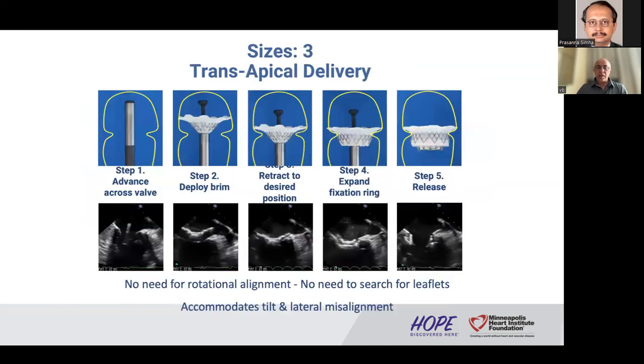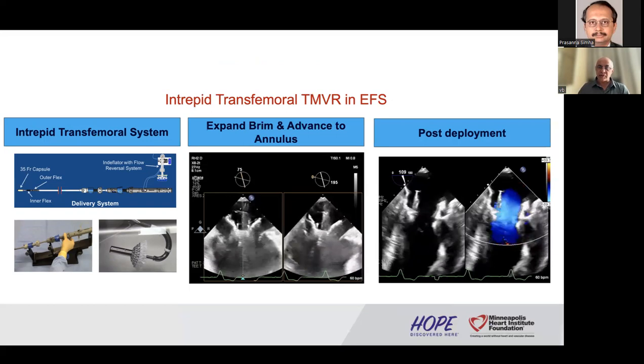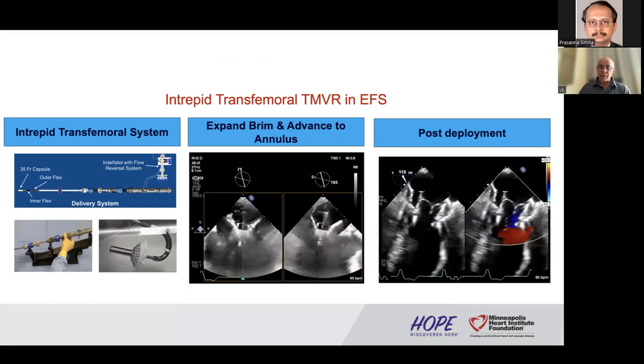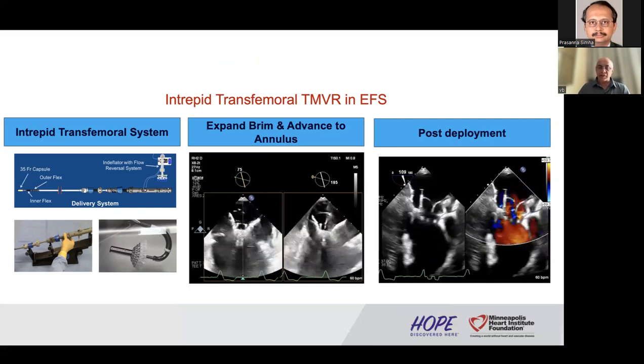As I said, initially the delivery system was all transapical, and there's a very large experience with this. We have recently published experience with 5-year and 2-year follow-up echoes on these patients, more than 300 patients now. You can see that the advantage of these devices, because they were bigger, was that they were easier to deliver directly into the mitral valve. However, this is more invasive, as the delivery system is as big as my thumb, and you're making a big puncture in a very sick ventricle. So now we are doing this case as transseptal.